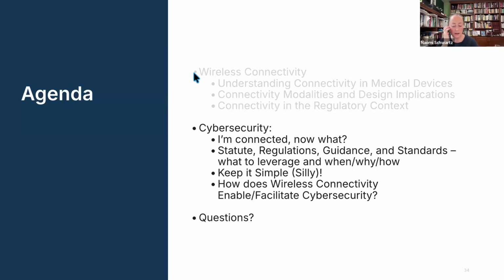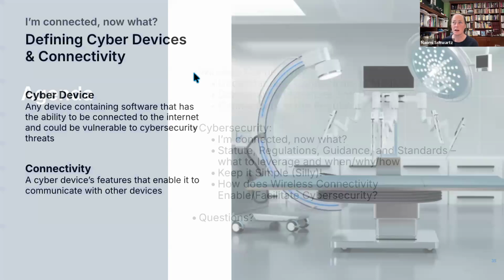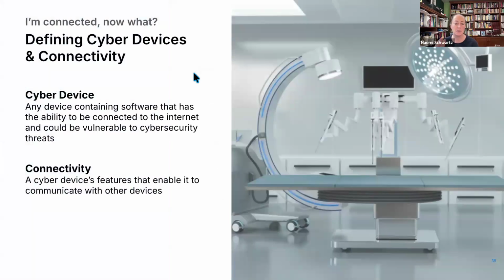Once you've got a connected device, you really do have to think deeply about what cybersecurity elements pertain to your intended use environment, the users themselves, and the connectivity modality. So it's really critical to ask yourself, now what? I have a connected device. There are really critical elements to the connectivity, or maybe the elements to connectivity are not so critical. What do you do about it? And how do you know if you're a cyber device? Well, if you're connected, you are a cyber device, for starters.